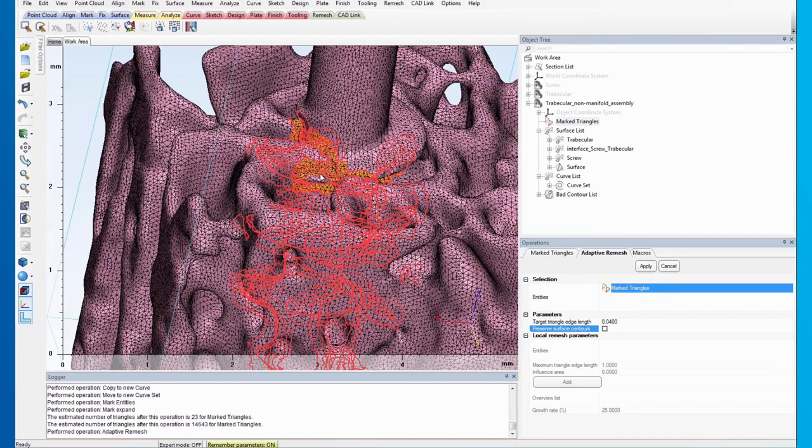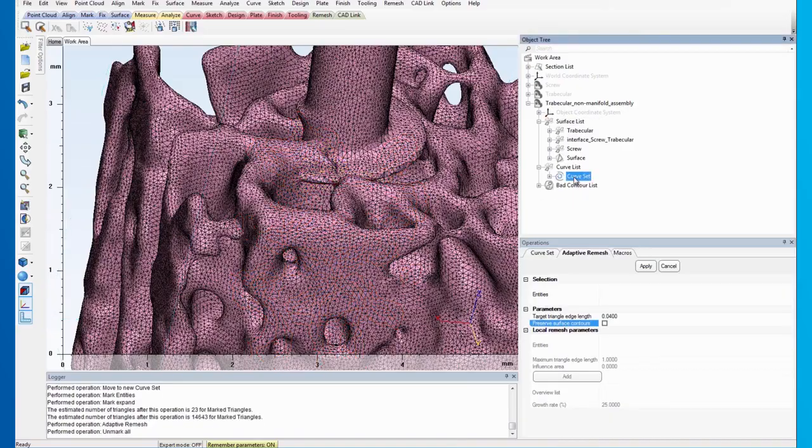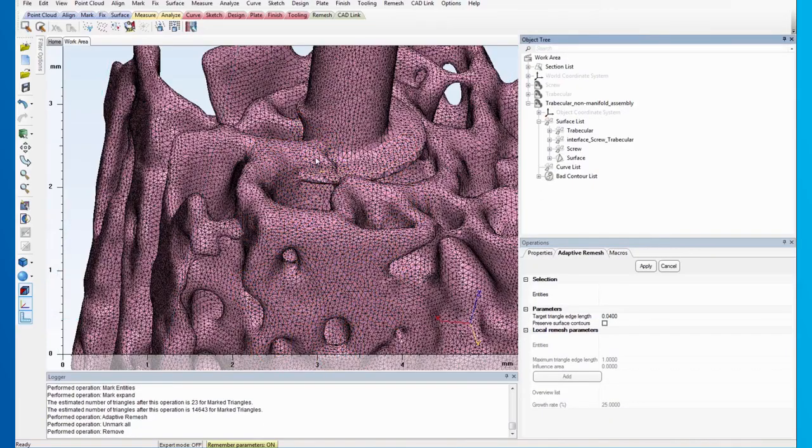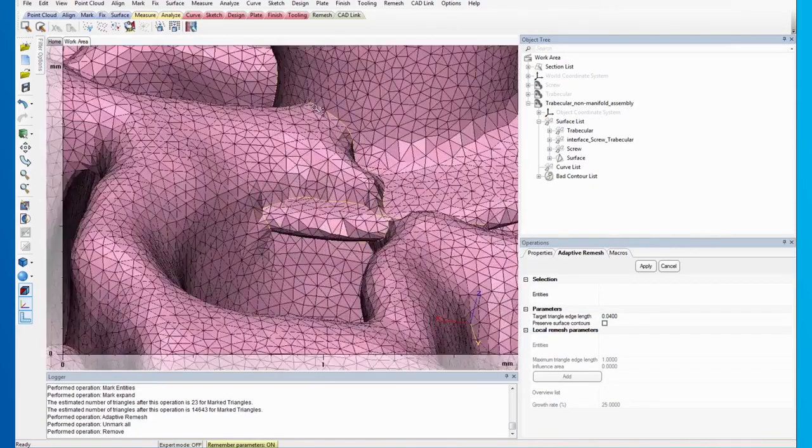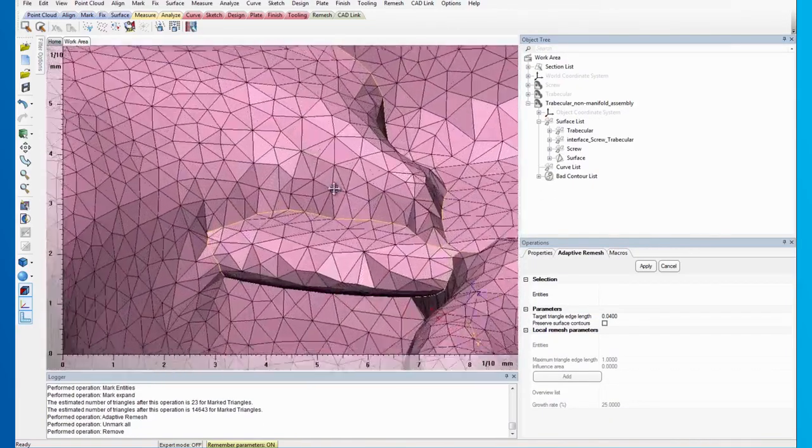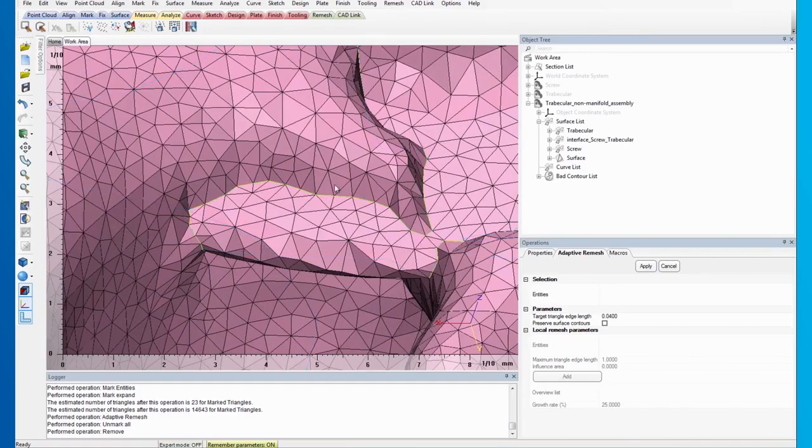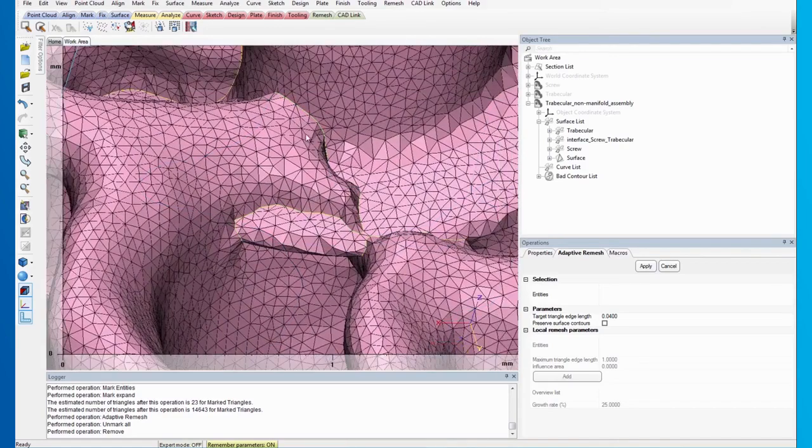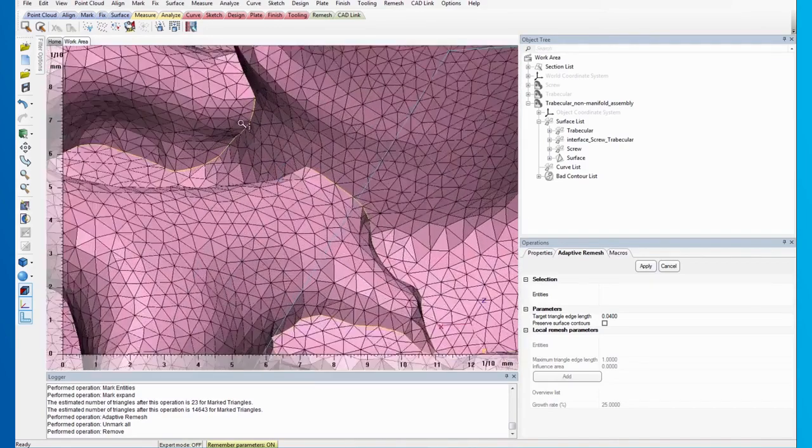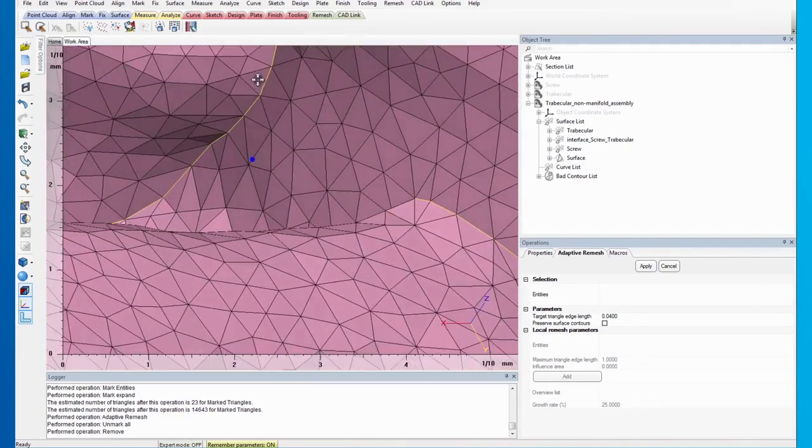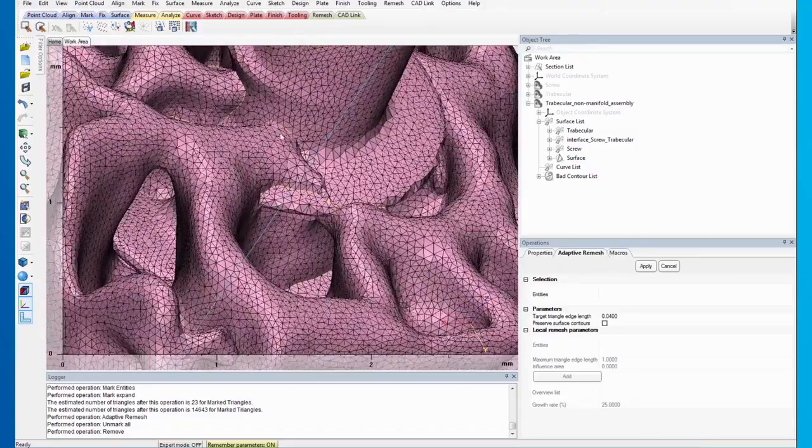right-click the work area to select Unmark All and proceed to delete the curve set from the object tree. Now, you will see that the triangles are much more regular and uniform across the bed contours.